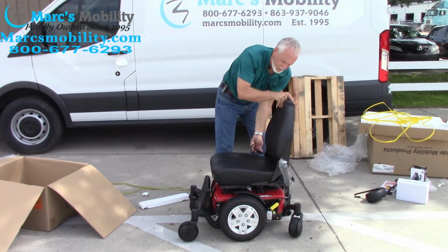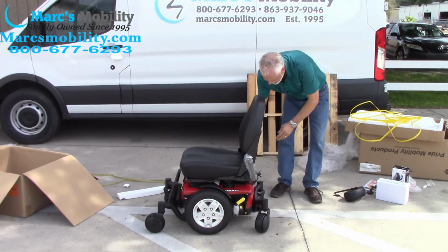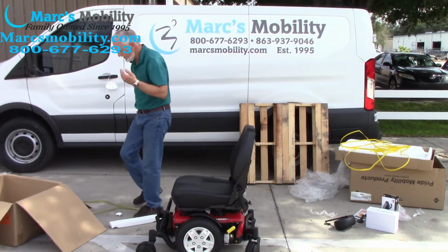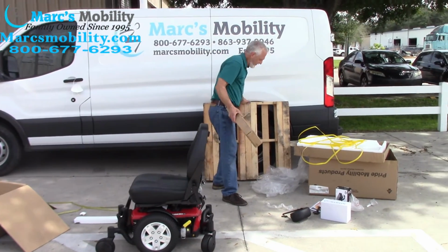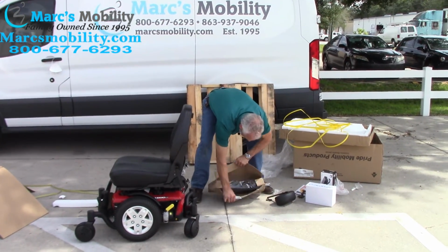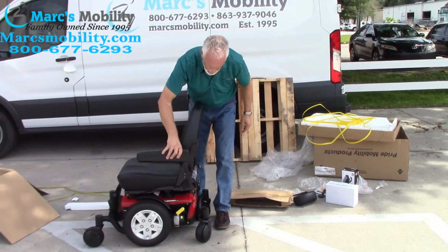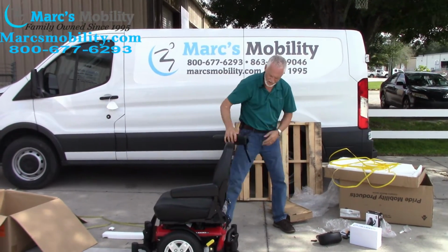The next thing you'll do is you'll pull your seat up because it's an adjustable back. You have 2 elbows, one on each side. One came out a second ago. You can take the plastic off of this. Okay? In your box, where your seat was at, there was the arms. So you'll open the box. Again, be careful. So you have 2 arms. You'll take the plastic off. It doesn't matter what side they go on. You can put one here. You can take the other arm out. Put the other one over here.